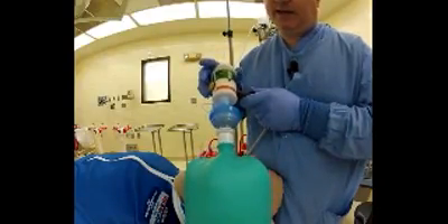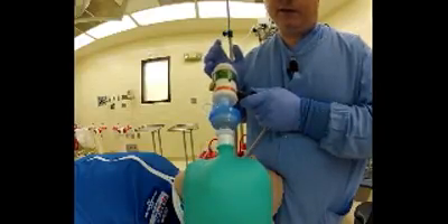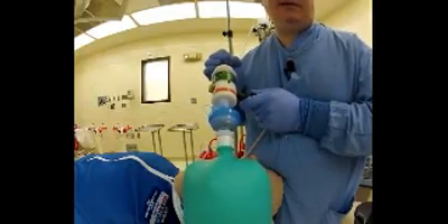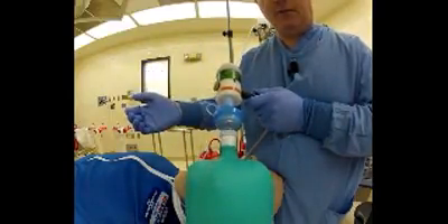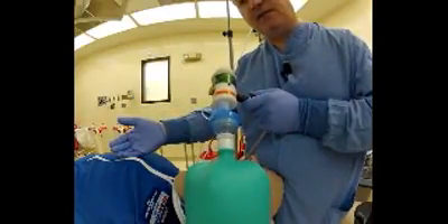I'm going to go to 20 PSI. Because the inspiratory flow rate is 30 liters per minute, the rate of gas flow per second is 500 CCs. I can set the tidal volume by knowing the amount of time that the inspiratory phase takes up. One second equals 500 CCs. Two seconds equals 1000 CCs. That's one second — that's 500 CCs of gas right there.